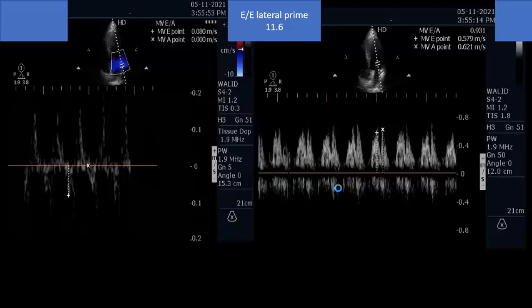You follow the stroke volume to confirm it is increasing and that the patient remains fluid-responsive by VTI, while simultaneously monitoring left atrial pressure to ensure you do not go too high and cause pulmonary congestion.